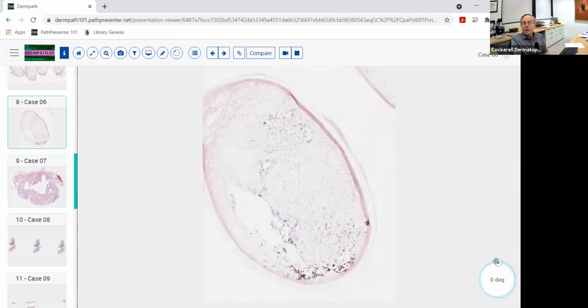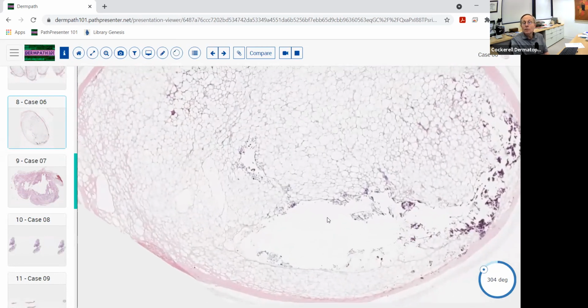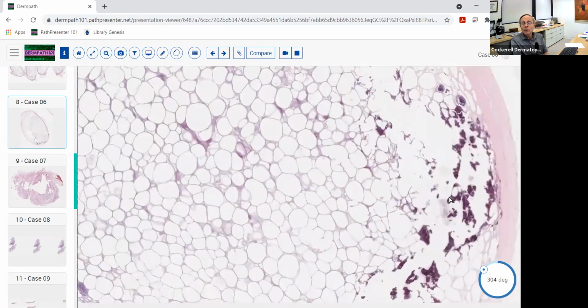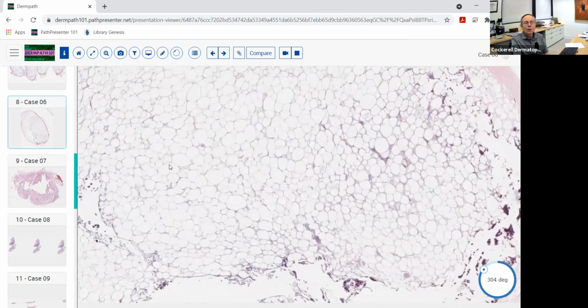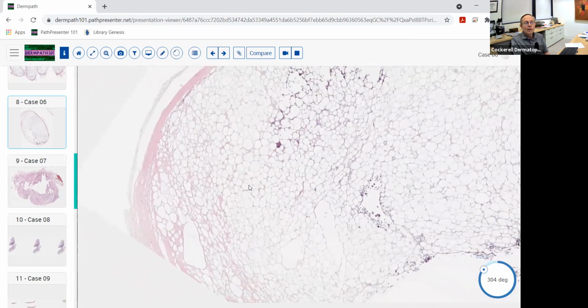Okay. Another example of a fat tumor. This we just basically call a garden variety lipoma. It looks kind of like the one we saw before. This one's got some dystrophic calcification over here. Again, probably what happened was the lesion got traumatized and then ended up getting some dystrophic calcification. So it's not a calcific lipoma or anything special. It's just basically another variant. And just a normal neoplasm, normal subcutaneous fat, no atypical cells, no brown fat. This is just yellow fat, and just another example of a lipoma.